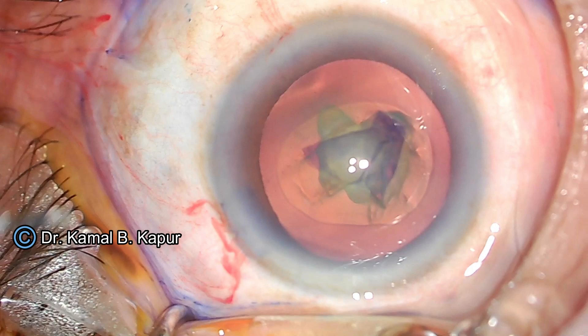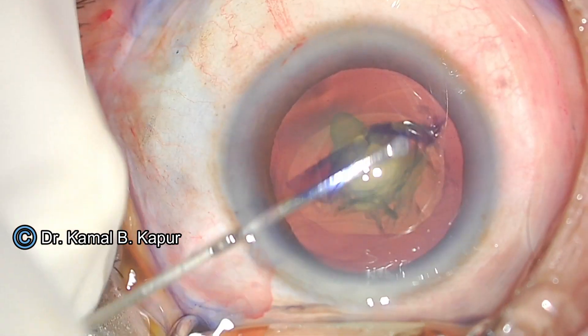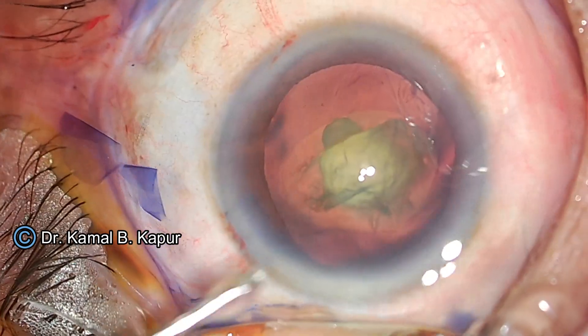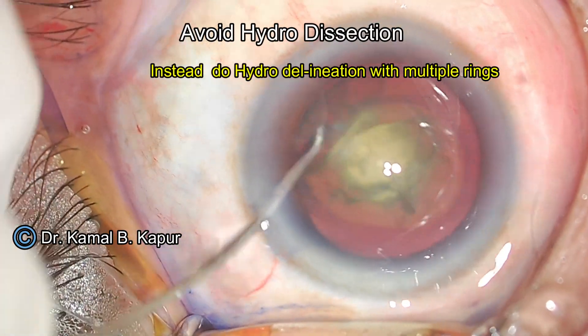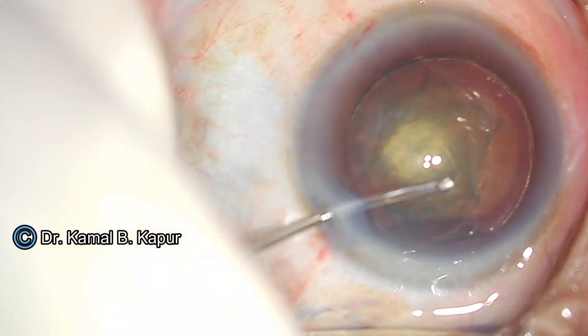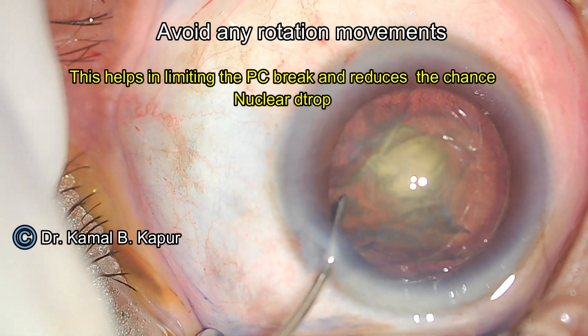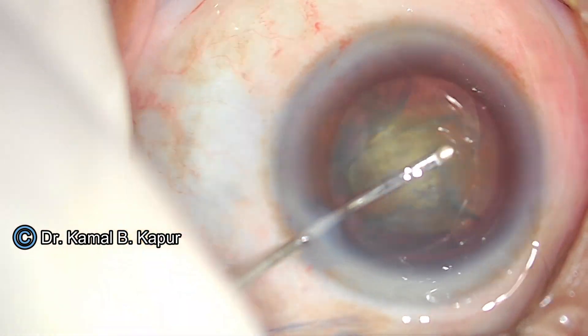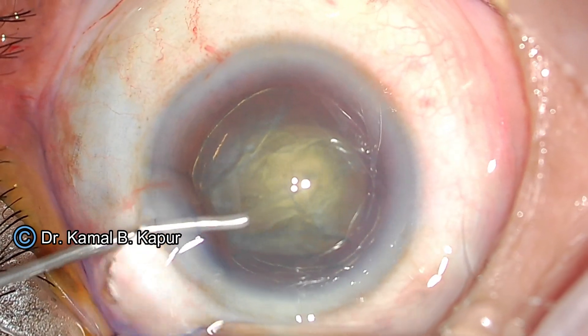Once an oval capsulorhexis has been done, this is a big advantage for getting the nuclear D segments out. If you want to scoop out the complete nucleus, you can just slip it out through the oval capsulorhexis. We have to be very sure that we do not do a hydrodissection in the posterior polar cataract, especially in this case. If we do a hydrodissection, we will end up losing the nucleus or some part of the cortex into the vitreous before the start of surgery.